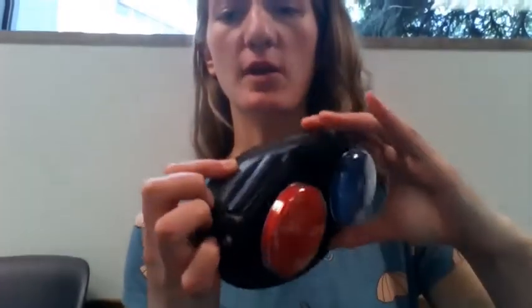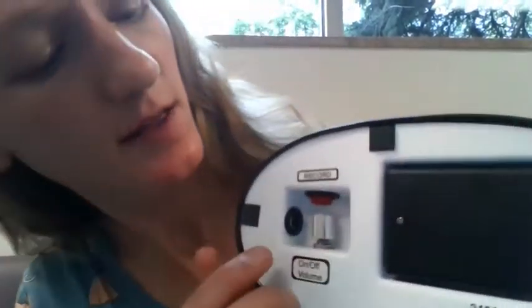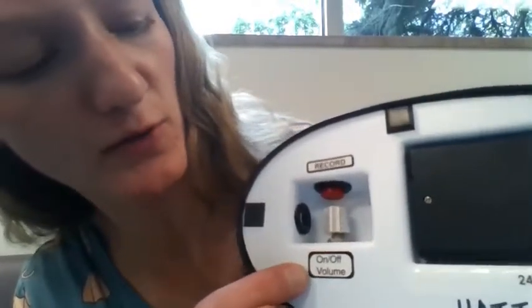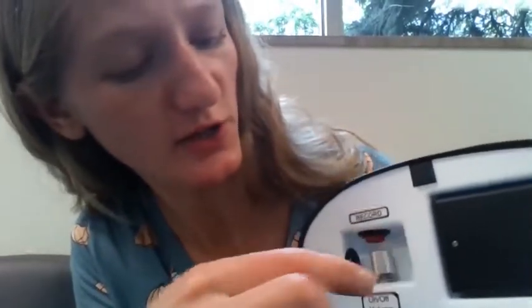Now, if you look on the back of the device, you see that it says record, and then there's the on and off volume switch. And right above that is this little red button. So in order to turn it on, I turn the switch all the way to the left. And did you hear that click? That means that it's on. If I want to increase the volume, I just turn up the switch even more. If I want to turn it down, I decrease it the same way.